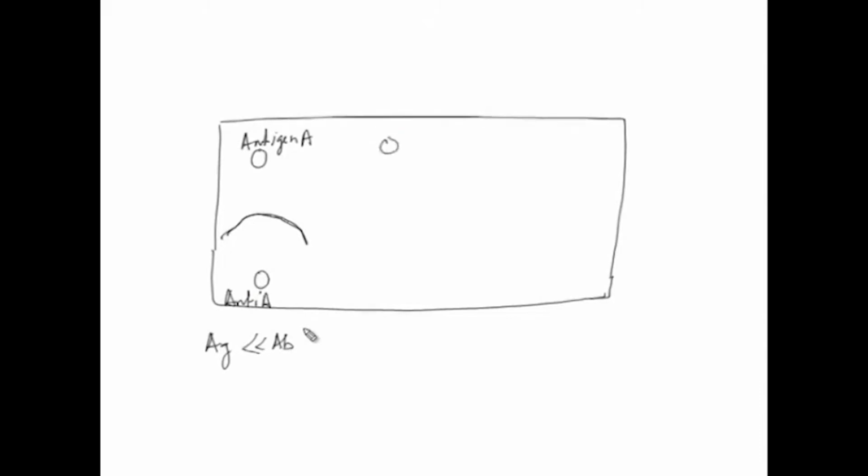There could be another one, say antigen B and anti-B. These are the slots we have in the agar plate, which facilitates diffusion because it has a large pore size; it is not a separation as such. Now, say the antigen and antibody molecular weights are equal. Then you will see a straight line rather than a curved line.